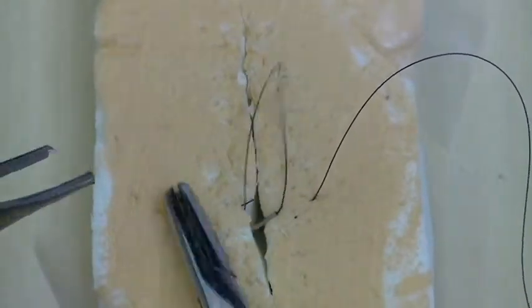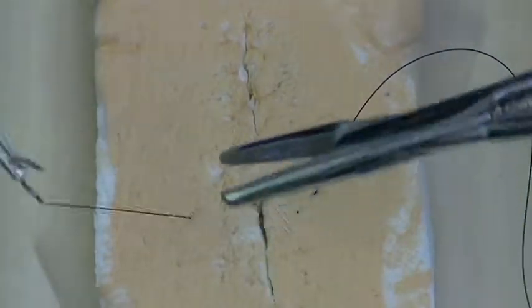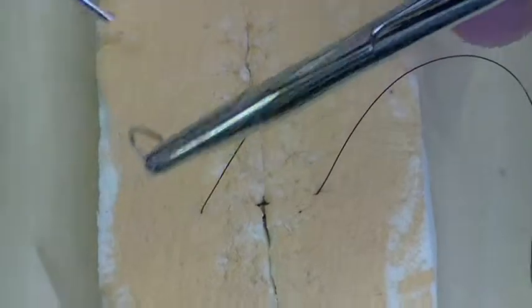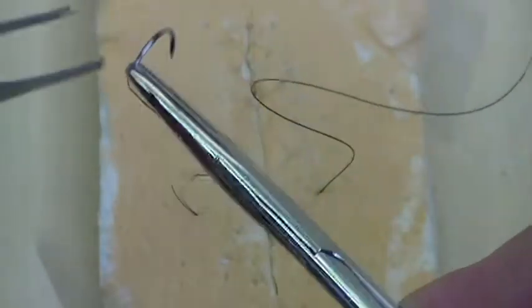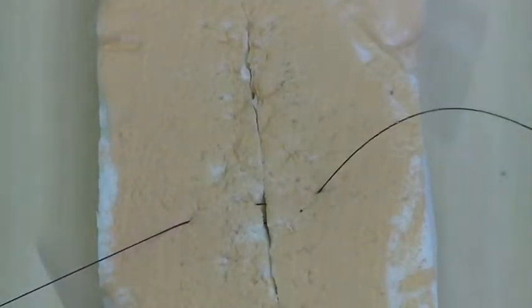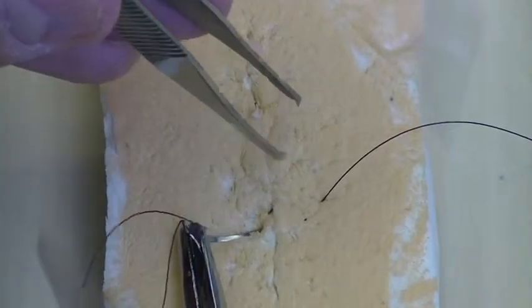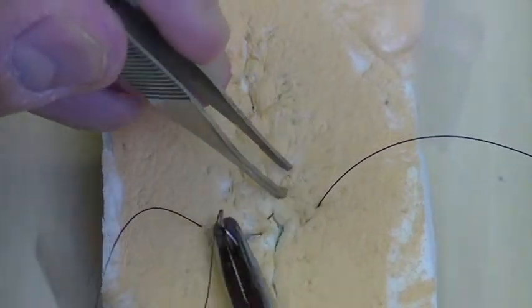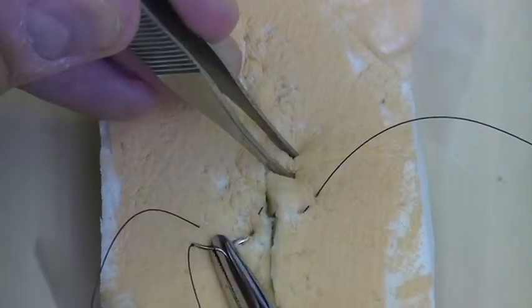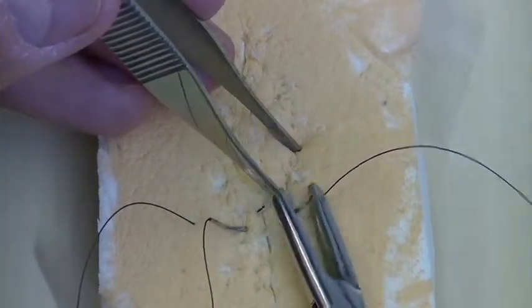Then you're also going to want to reverse the needle. Pull your tail through. And here we're really just going about two or three millimeters from the skin edge. You're not taking away too much. It's going to provide that good approximation that you want and also evert that little part of the skin edge right there.